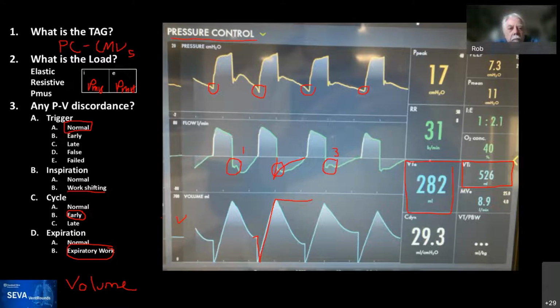Absolutely. And just going back in time, this has been done in the past, in which the transtracheal gas insufflation, or actually deflating the cuff on the high frequency oscillator, was another way to get rid of the CO2 and clearing CO2. So that's an important feature. Having a leak will affect the CO2 clearance. As the leak closes, you have to take into consideration that the CO2 clearance may get worse.